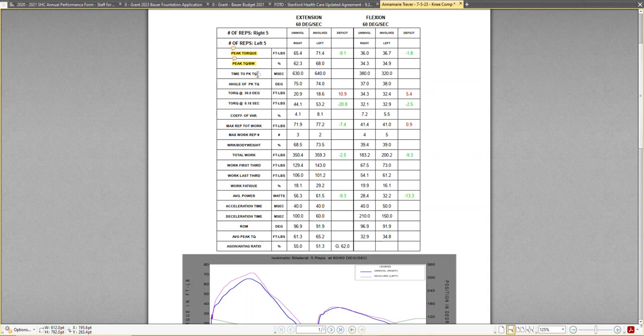They've also shown that your cueing matters to the patient. You can't get an accurate rate of force development off a test whose sole purpose is peak torque, because the instructions you give to the patient actually matter. If you're looking for peak torque alone, you would say, I need you to push as hard and fast as you can, with the emphasis on hard coming first. If you wanted rate of force development, you would reverse that: I want you to push as fast and hard as you can.